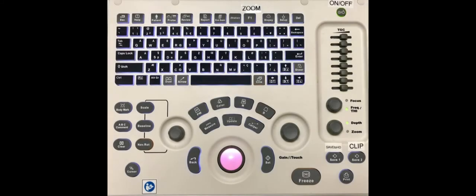Let's take a closer look at the keyboard knobs and buttons. We have already used the on button and also the probe button. We've used the trackball mouse and also the set button. On the right-hand side of the keyboard is a panel that contains a number of sliders and knobs.